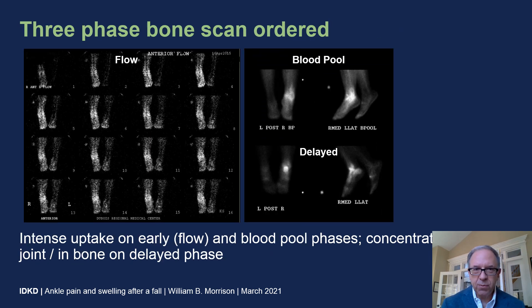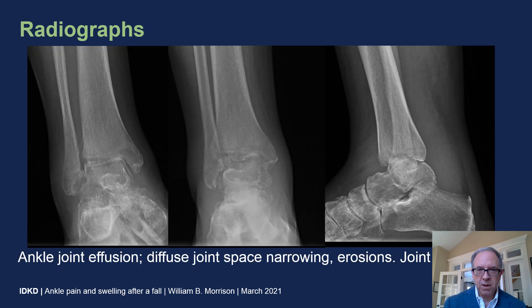A three-phase bone scan was acquired. We see on the early flow phase that there is rapid uptake around the ankle joint. In the blood pool and delayed phase, there is concentration of radiotracer in and around the ankle joint. Radiographs acquired at the time now show diffuse joint space narrowing and erosions as we saw on the MRI.